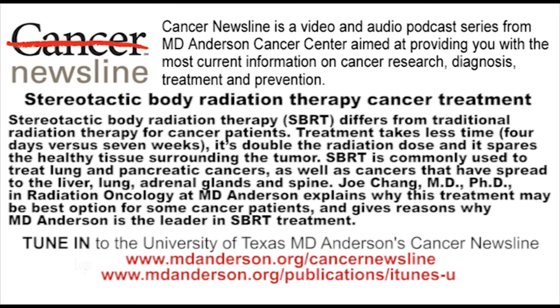So it can combine with other types of treatment together in many disease situations. And what about the patients you've used SBRT on? What sort of reaction or feedback have you gotten from them? Well, most of the patients I see after 5 years of lung cancer are patients who were treated with stereotactic radiation therapy. You mean reaching the 5-year survival mark? Mm-hmm. Right, because it's definitive treatment, we aim for cure for early stage lung cancer.